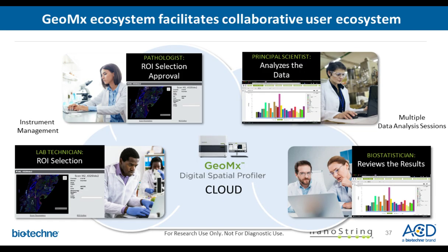And it's built in a cloud architecture. So while it runs on the system, anybody from their computer can essentially go to Google Chrome, log into the system, and can do many different aspects of the data analysis and ROI selection there.